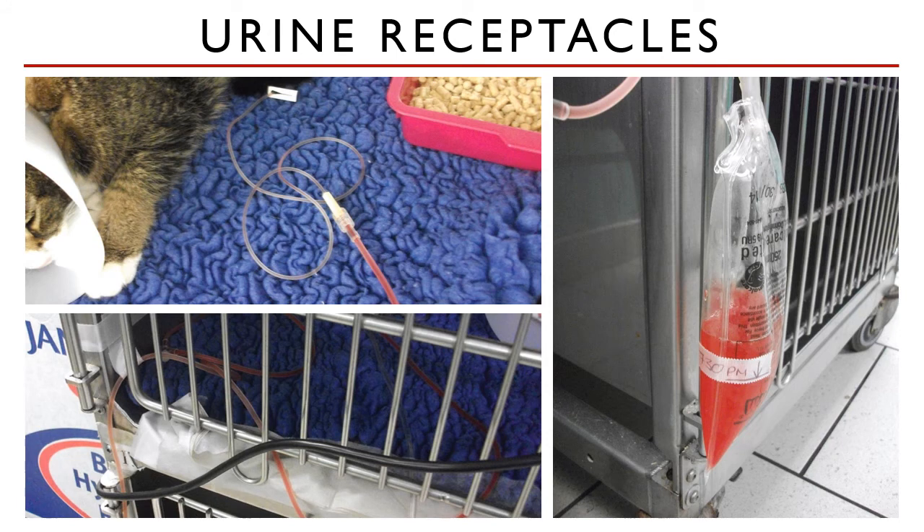If commercial urine bags are unavailable, the urinary catheter can also be connected to an IV drip line connected to an empty IV bag. However, this still works with gravity. The animal must be placed on an elevated cage and the bag receiving the urine must be placed near the floor below the patient to keep draining urine. If you place the urine bag at the same level as the animal, it simply will not work — your fluids need to be positioned lower than the animal for urine to flow out, employing the same concept as IV fluid therapy in reverse.